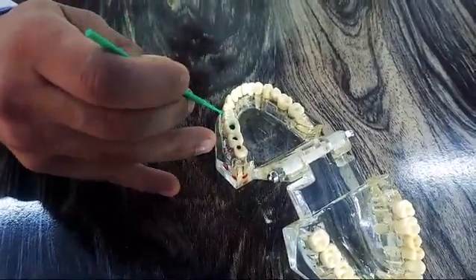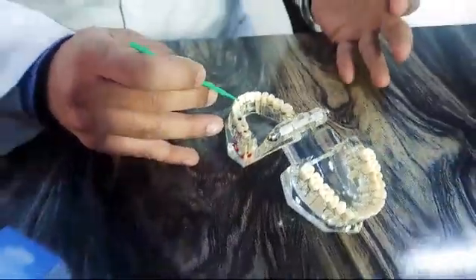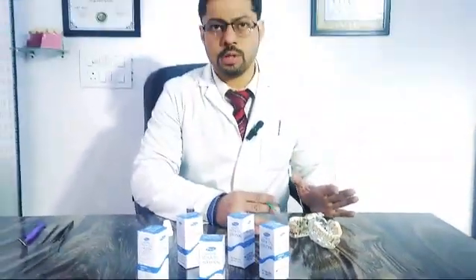After application, let it sit there for 10 seconds and then you can wipe it out, and you'll get a nice clean dental cavity. That's all. Thank you so much for watching our video. Happy practice!